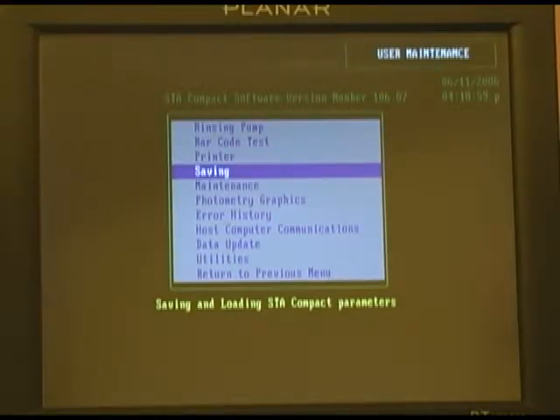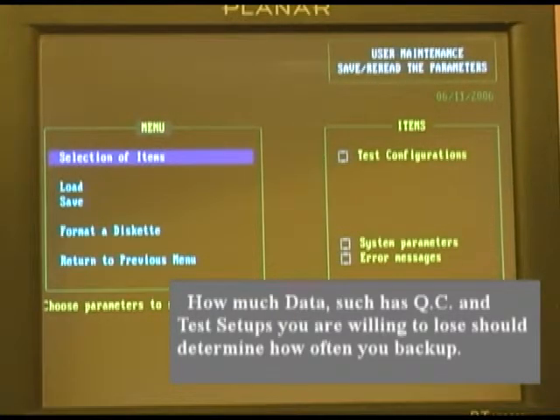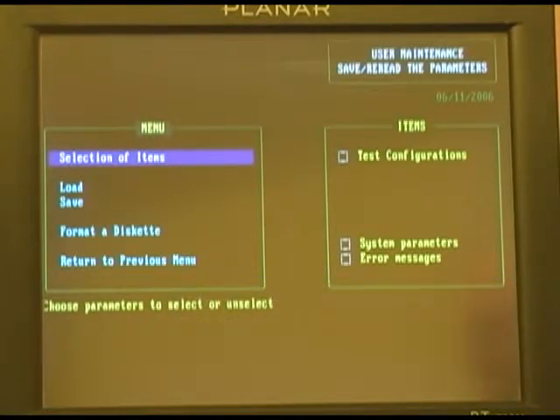Moving on to saving, it's very important that you save your information regularly. In order to do that, we'll select our saving option, and what I recommend is that you routinely, as part of your daily or weekly maintenance, go in and save your test configurations, your system parameters, and your error messages on a routine basis. It's best to do this on two different disks, a disk A and a disk B, and alternate your saving routine between those two disks. That way you always have one good working disk in case one disk should happen to fail.